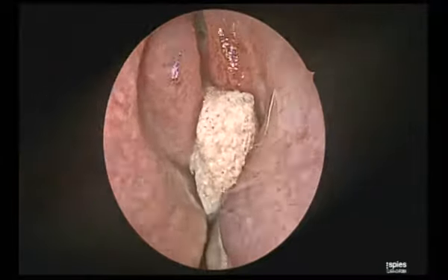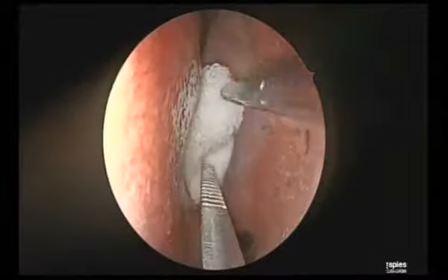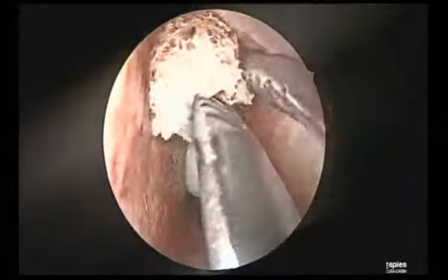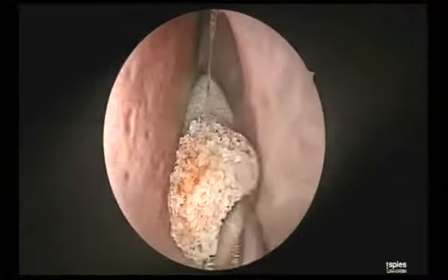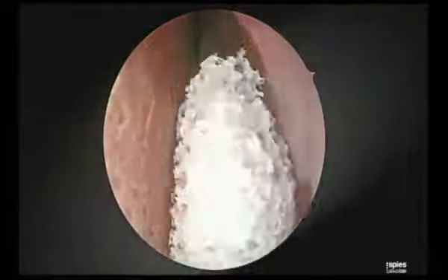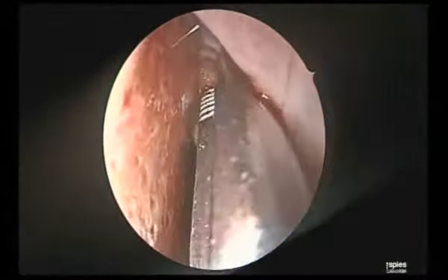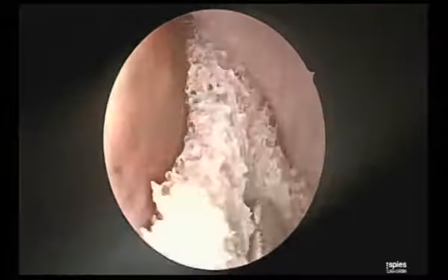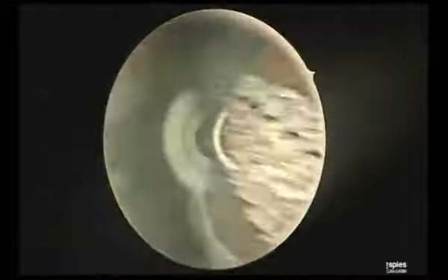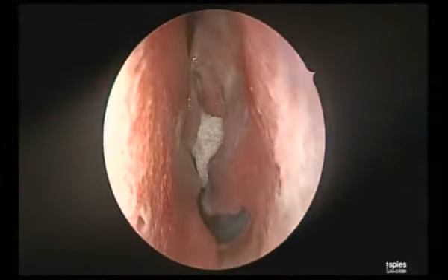Now watch how he is painting everything that is going to come in the way of his endoscope. It's not just the target area. See, also the septum, also the inferior turbinate. This is a secret that makes his field look so much better. Otherwise we tend to go into the middle meatus and do it only there. He's bringing it in and out, and this is the application of the adrenaline-rich solution to the entire pathway of the endoscope and the instruments.